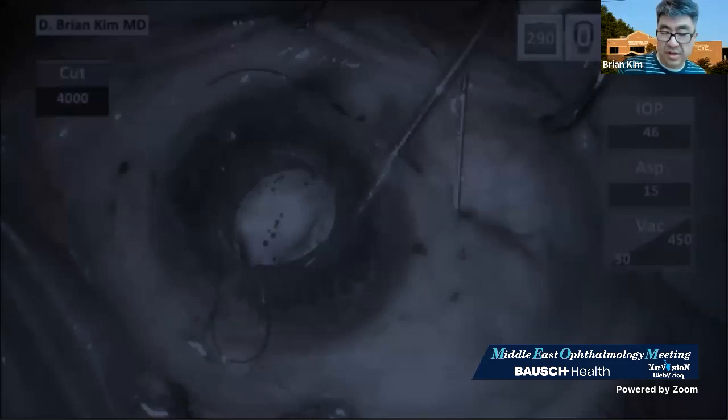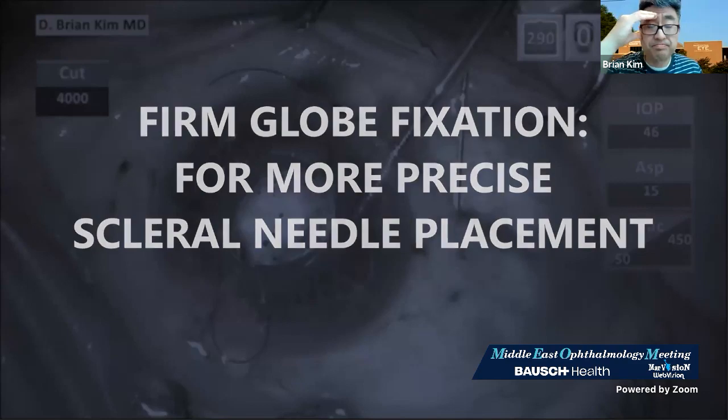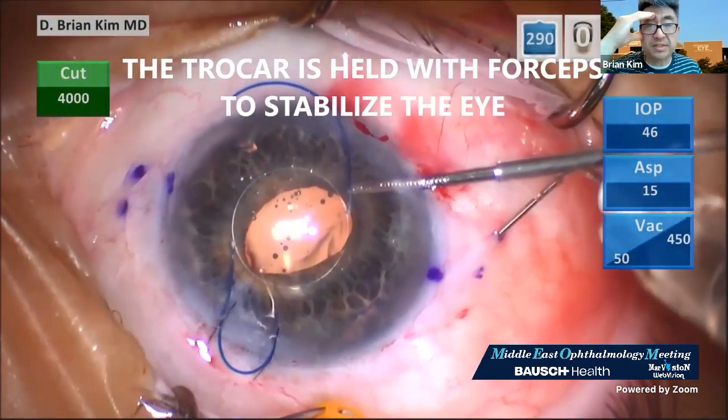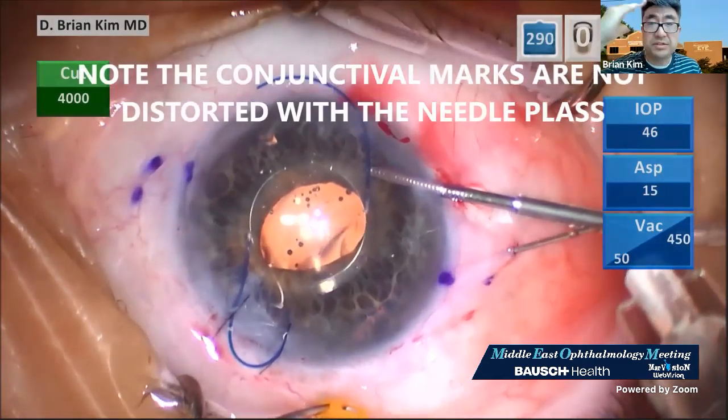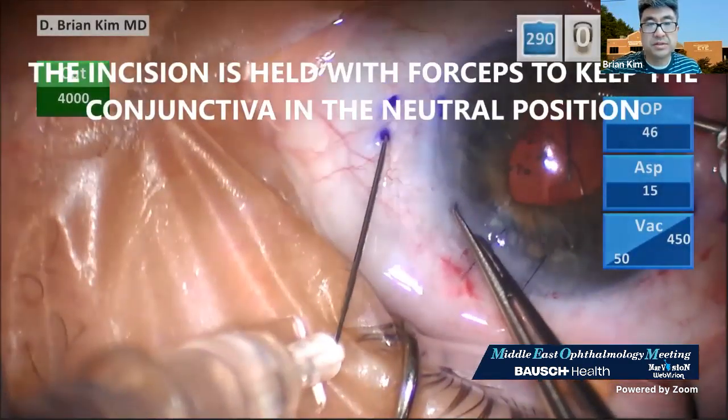And this is just a video illustrating my point. The trocar is held with forceps to stabilize the eye. And you can see that the conjunctival marks are not being distorted with the needle pass.